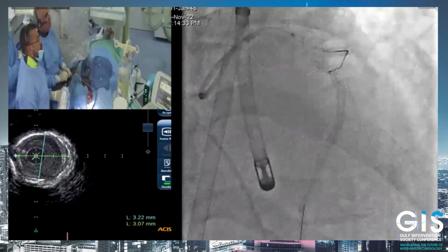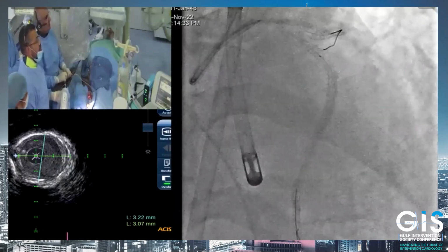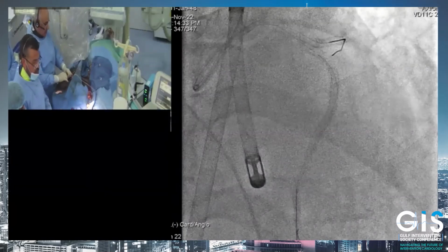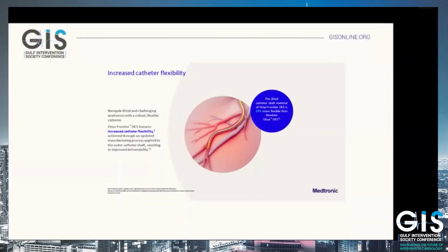PA caudal might be helpful. I don't know. No, I don't think it's going to the CX. Okay, it's looping actually. Again, because of the angulation, it's really not helping much. So if you want, I can do a run of IVUS one more time. It's quite sharp angulation with calcium chunk there.